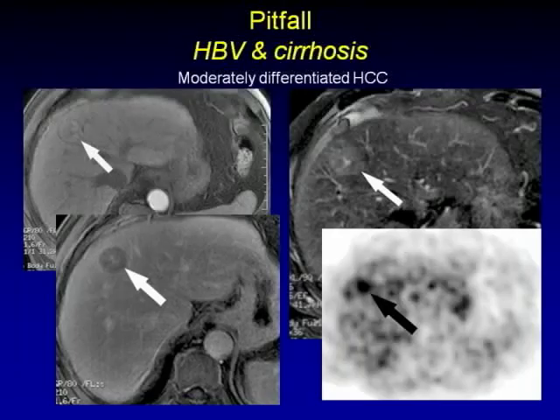Okay, so that's helpful. Now that we've gone over what the classic appearance of an FNH is, the fact that it's arterial homogeneous enhancement, the fact that it's well circumscribed, more common in women, there should not be underlying liver disease. That's really important. When you make a diagnosis of an FNH, you should not do it in the context of underlying liver disease such as cirrhosis or HBV. These should be an incidental finding.